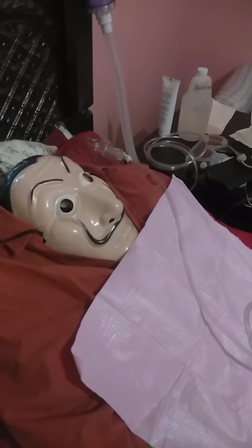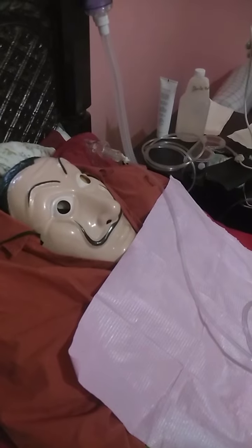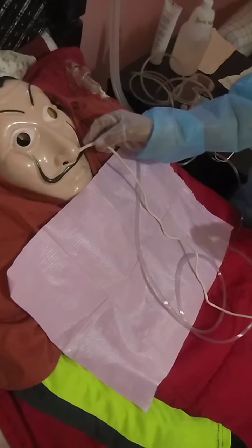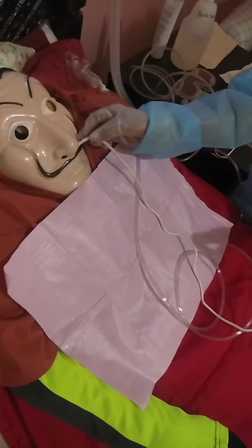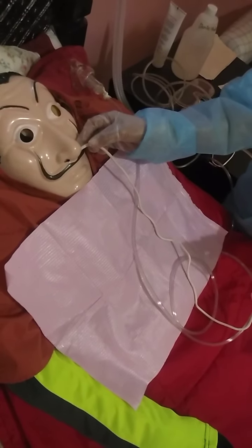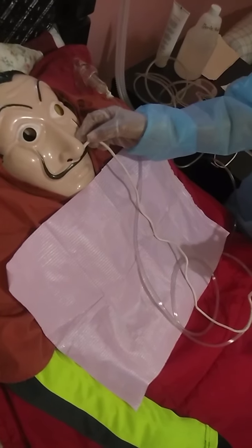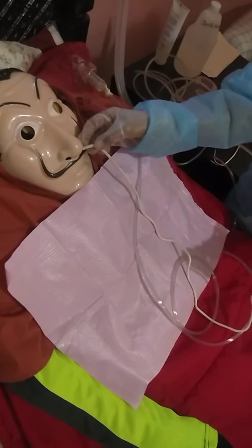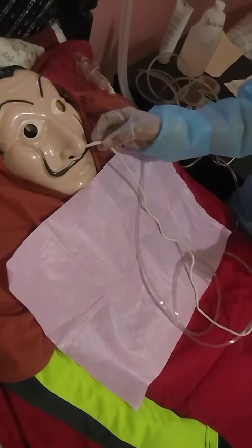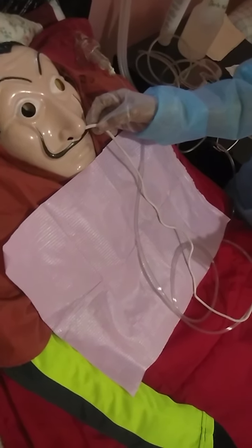As you insert the catheter, do not cover the catheter vent. Follow the natural course of the nare and orient the catheter downwards slightly. Don't force it. If you feel resistance, you have probably hit the carina. In that case, withdraw the catheter 1 to 2 cm, or 0.4 to 0.8 inches, before applying suction.